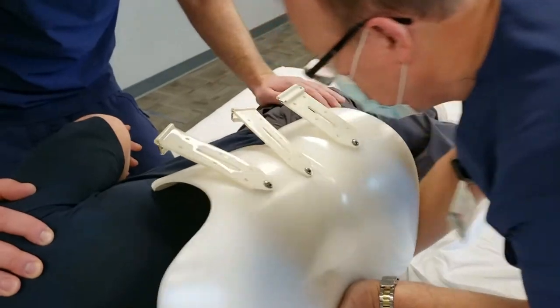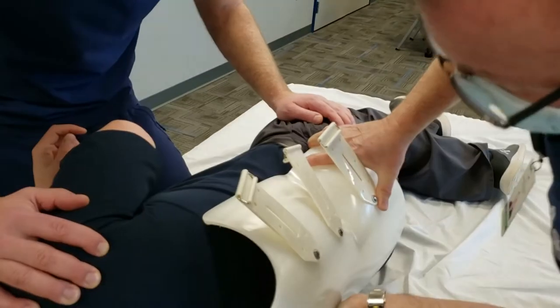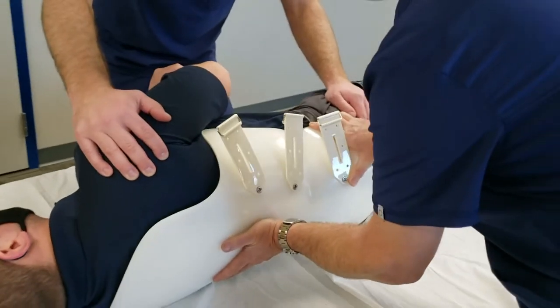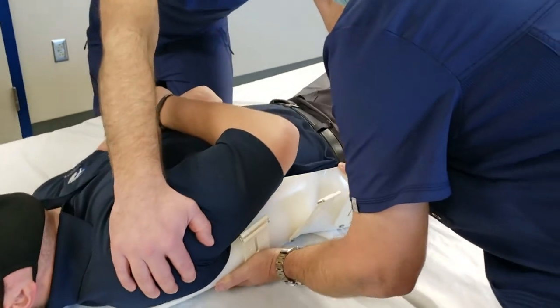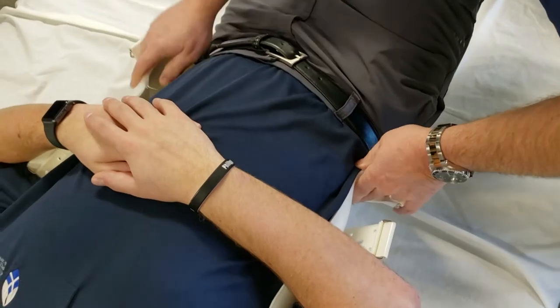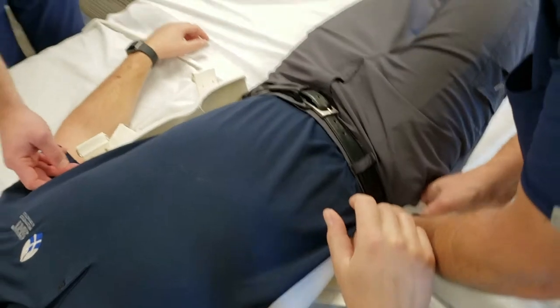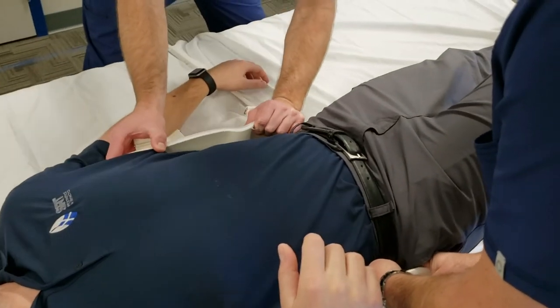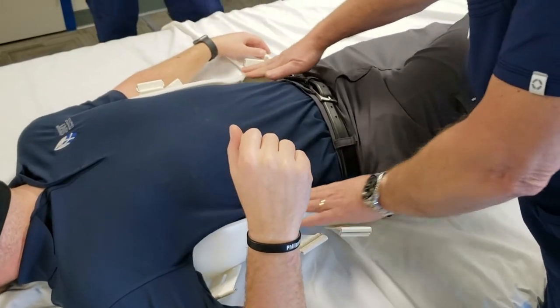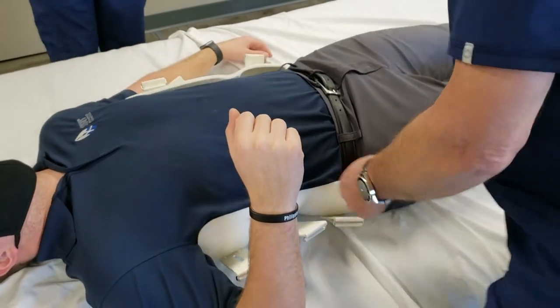The further you can have the patient roll, the better that is. Let's have him roll back towards me. Then you want to check side to side — this side appears to me like it needs to come down a little bit. I'm going to hold mine; if you want to pull down on that a little bit. There we go — that looks better. We're pretty even from side to side. It doesn't always have to be perfect, but it should be pretty even.